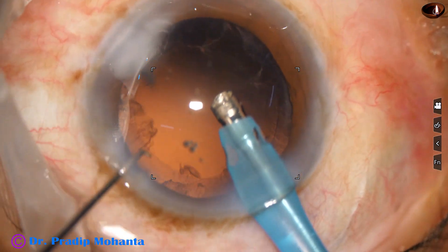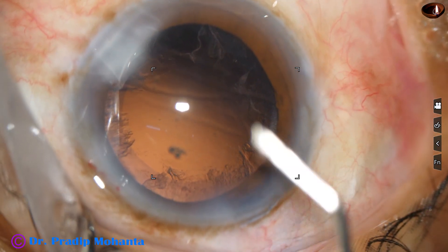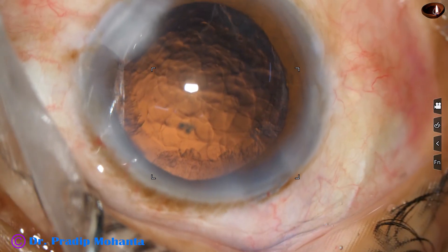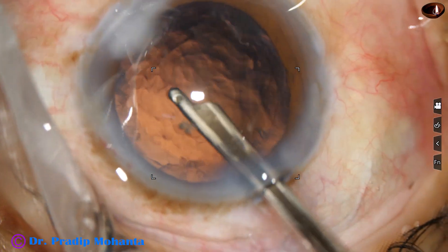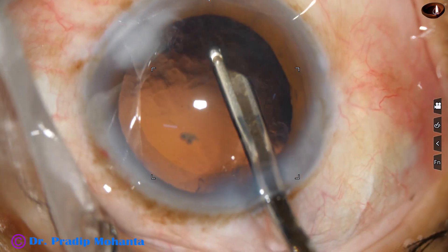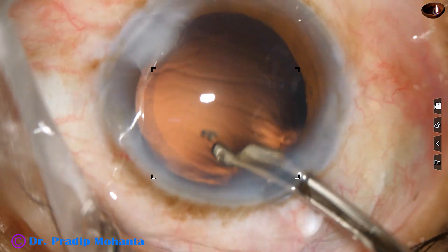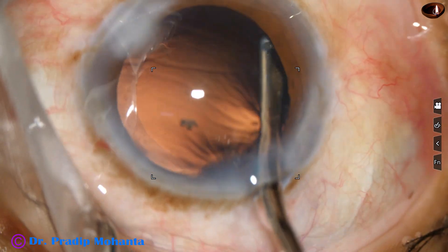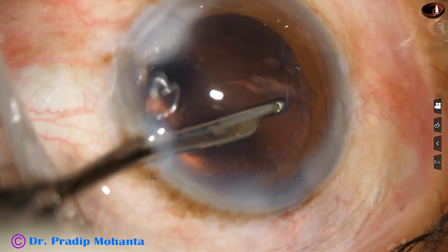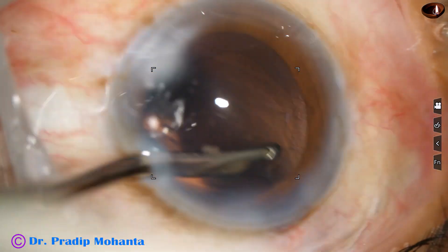Done. Some nuclear bits are removed through the side port. I have made only one side port. The size of this side port is about 1.6 to 1.8 millimeters, so that a 23-gauge Simcoe can go in. The side port is about three clock hours away from the main incision, so astigmatism produced by the main incision is neutralized to some extent by this slightly large side port. The Simcoe goes through the side port and the sub-incisional cortex can be easily removed.